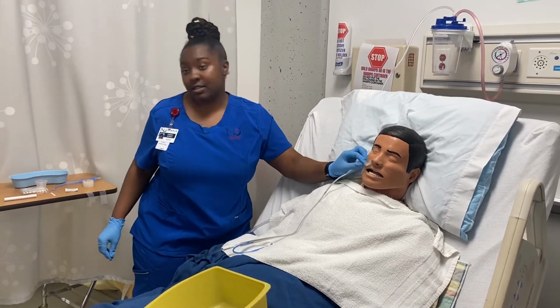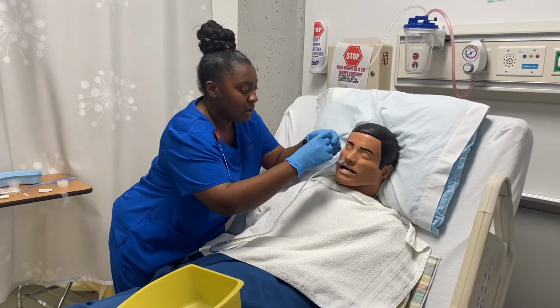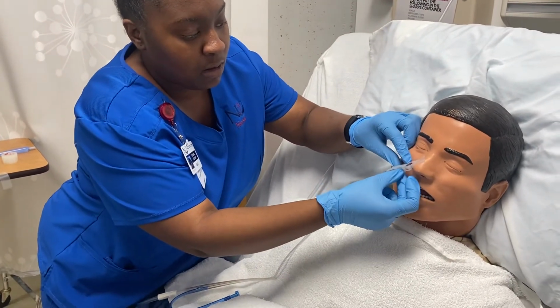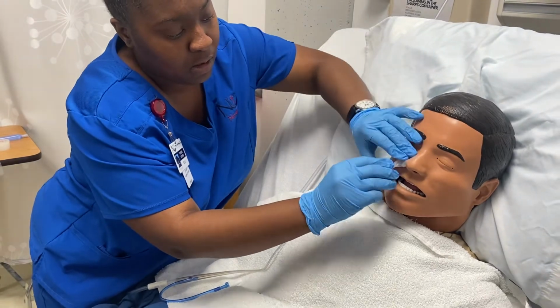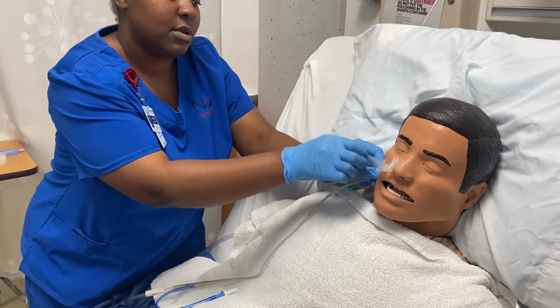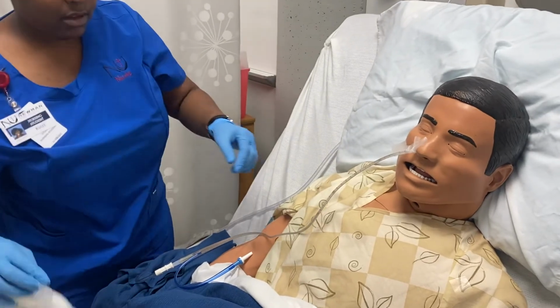And then now I'm going to secure the NG tube. Now I'll kind of fix it so it's not interfering with the other piece of tape. Take this towel off.